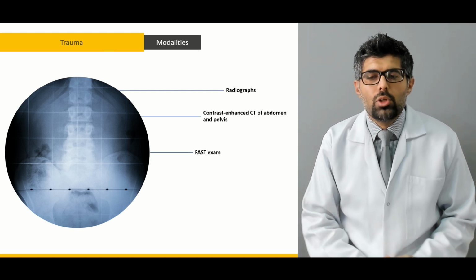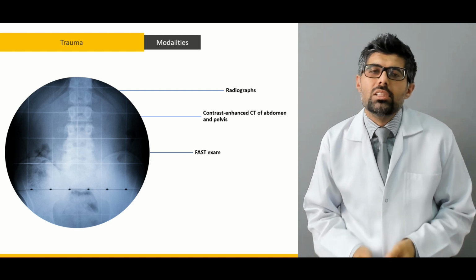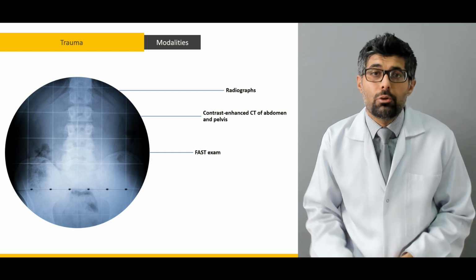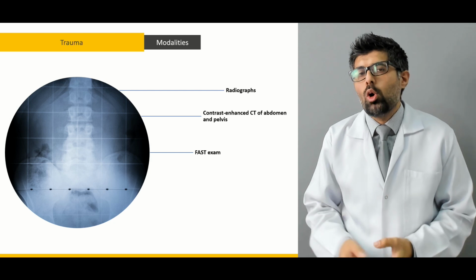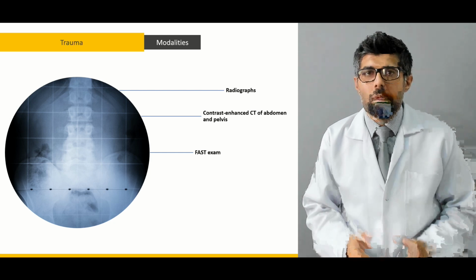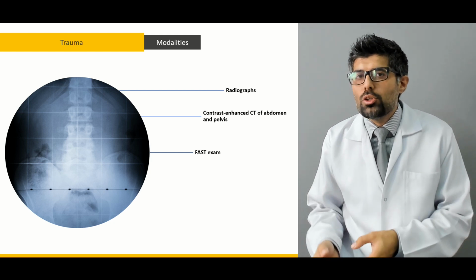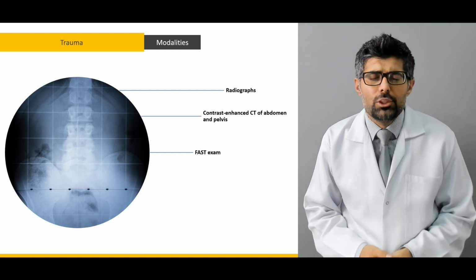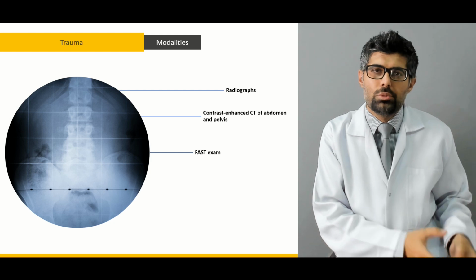The next modality that we use is a FAST exam. Now FAST stands for focused assessment with sonography in trauma. Now during trauma, the patient is always in an emergency. So in order to perform any kind of imaging, usually all of the treatment, the stabilization of the patient has to be stopped and the imaging process has to be started.